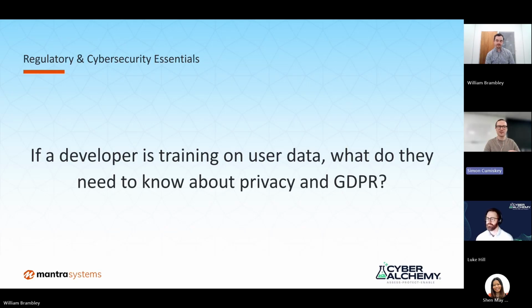And it's important, because if it's improving, you might go, oh, that's a positive, just move on. But no, whether the performance is improving or decreasing when you apply it to a new patient population, it suggests that there's an issue in there that you hadn't previously considered. So yeah, post-market surveillance is just as important for these types of medical devices as for all types of medical devices.